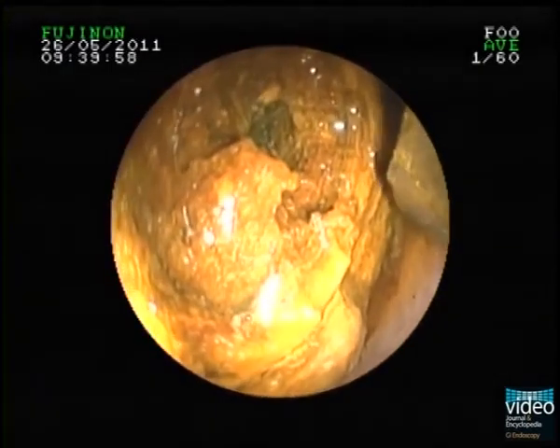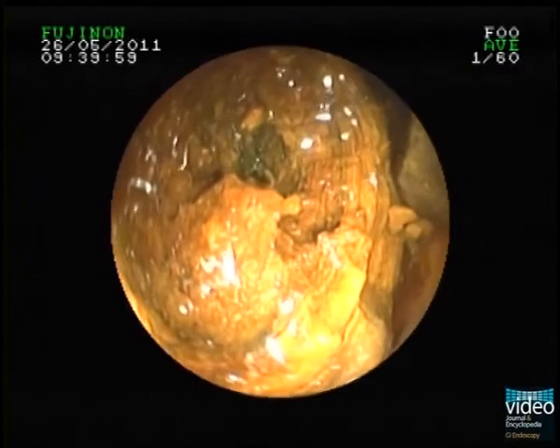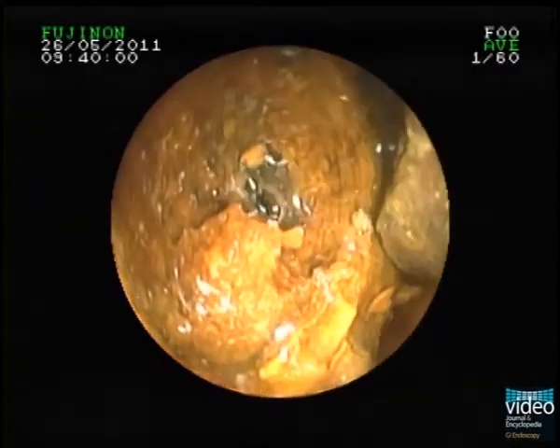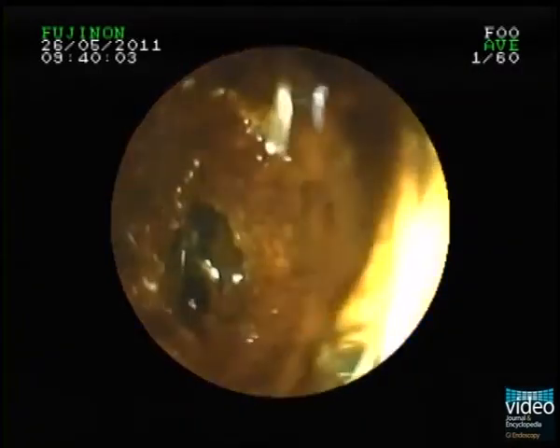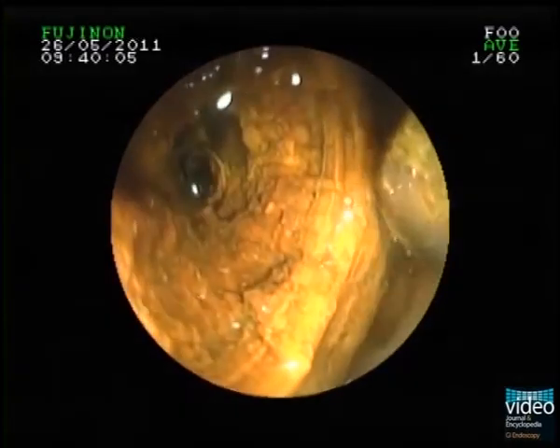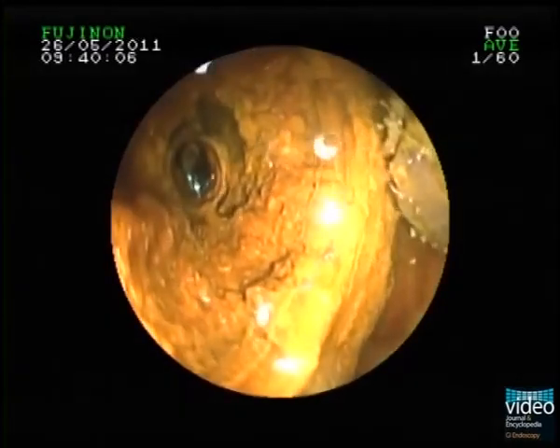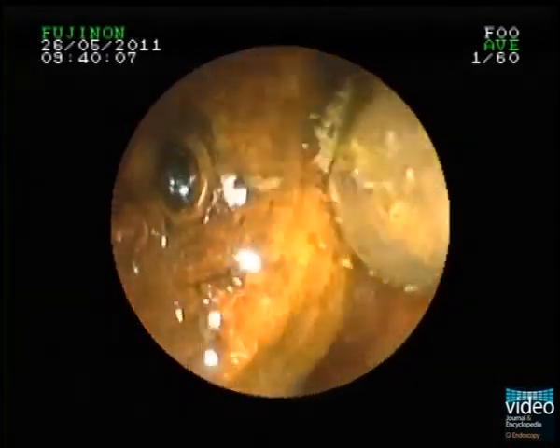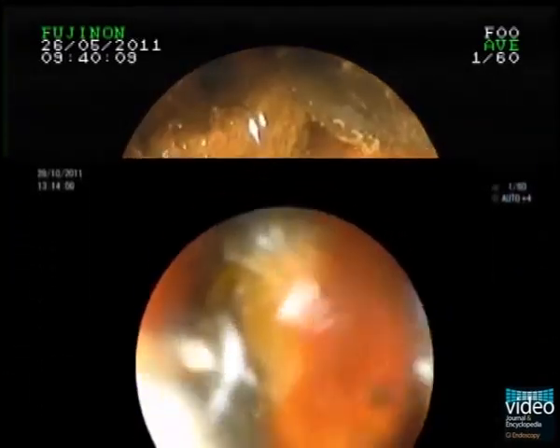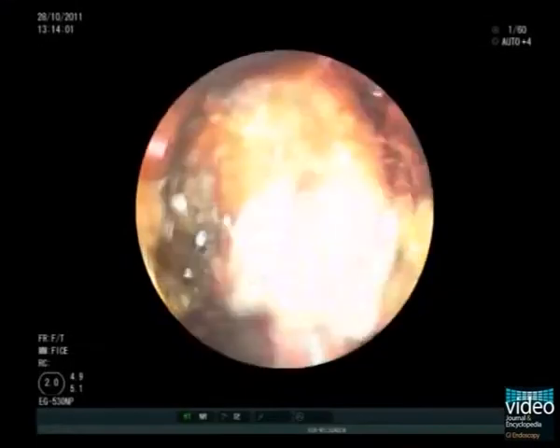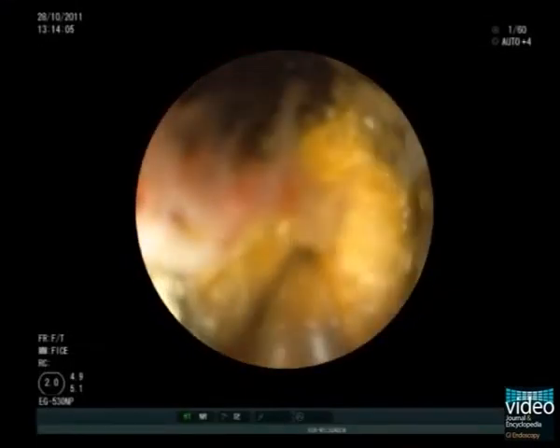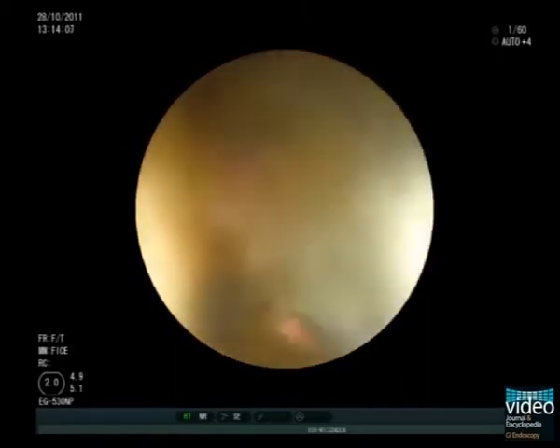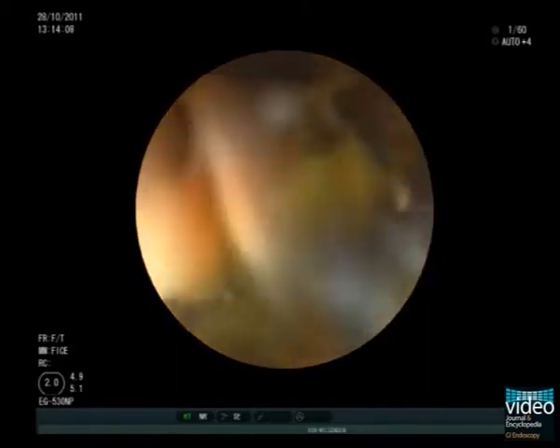Here we already notice a big crack within the stone, and we get a fascinating insight into the composition of the stone. For repeated shockwave delivery, the core of the stone is targeted.